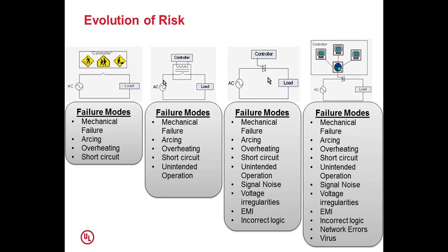So here, this is a very significant flowchart. If I would like to see, as the technology goes forward, we will have more and more failure modes, and we have more and more risk coming into the picture, which we need to address during our development process.